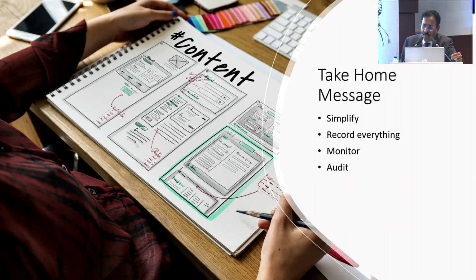So the take-home message is, more than doing the process, documenting is very, very important for two aspects. One is the regular auditing and training purpose. Second is the medico-legal aspect. If there are untoward events like endophthalmitis or cluster endophthalmitis, these are the records that will save you in the court of law. So you need to have proper documentation.